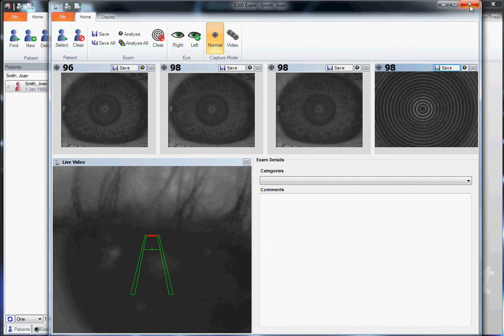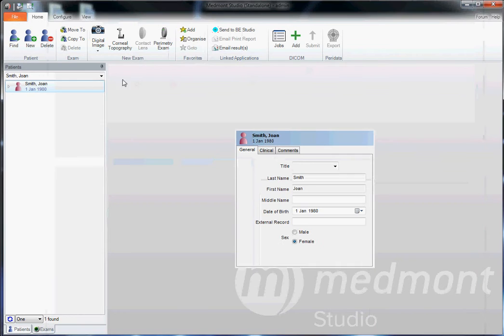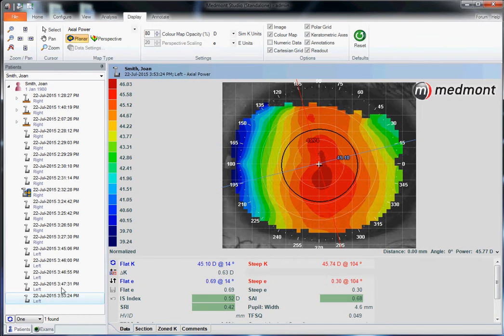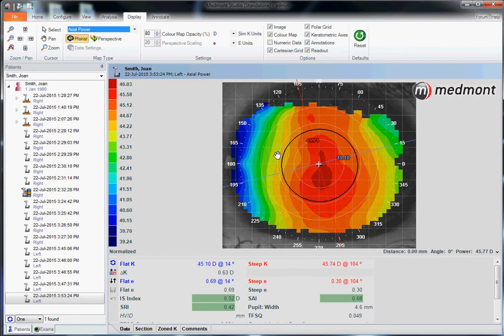If you want to analyze those images, close down the capture window, open up the patient file, and click on the topography. Go to Display and look at this eye axially.